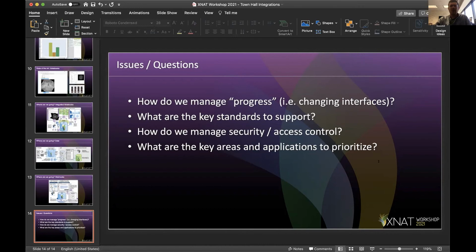I think at one point we had a dynamic anonymizer that could apply an outbound anonymization script as images were being exported from XNAT. Tim? Yeah, we've had beta implementations of that. I don't know that it's made it into a production release of XNAT. We have done systems where, as you access or download the data, it goes through an additional stage of anonymization.